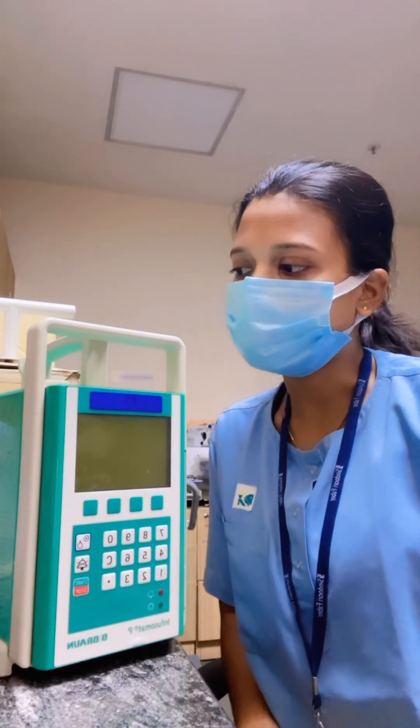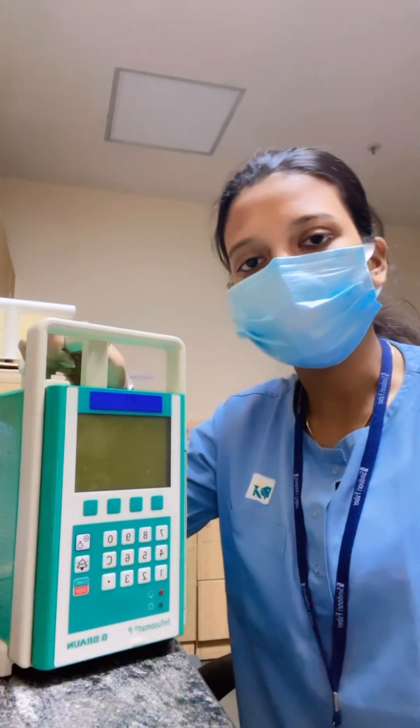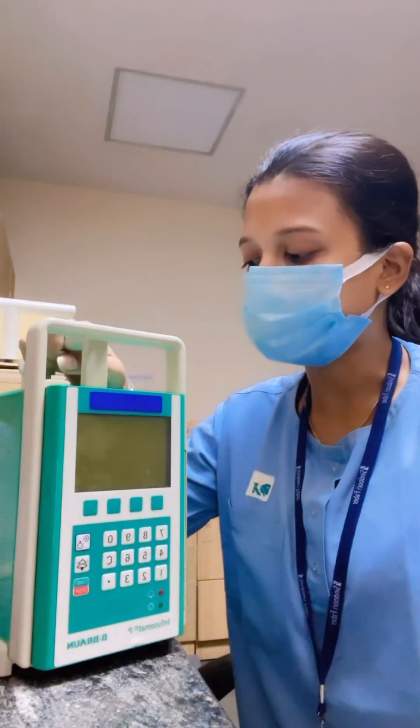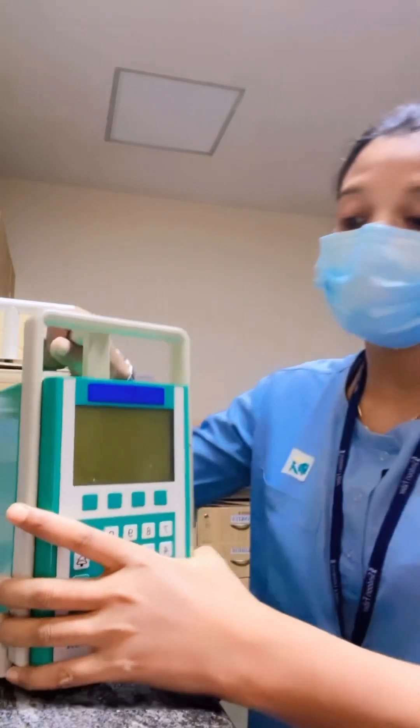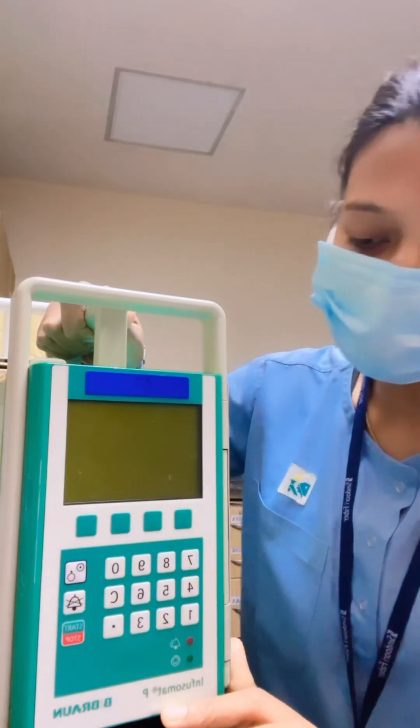Hello everyone, I'm Tanushi from the biomedical department. Today I'll be talking about infusion pumps, which are mainly used in the ICU. First, I'm going to show you the various components of the infusion pump. This is the B. Braun pump by Inferior Modulus — the Infusomat P.